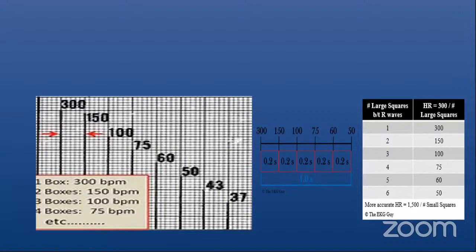Actually, what I am asking, because of course the pulse ox is going to be there, and they have the leads also. But I am talking about the real time ECG too. No. I wouldn't say the 12 lead ECG. 12 lead ECG is going to be very difficult, so it's not going to be possible. Obviously, you have to have some sort of a rhythm lead.